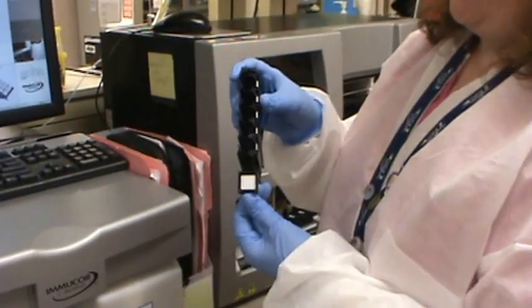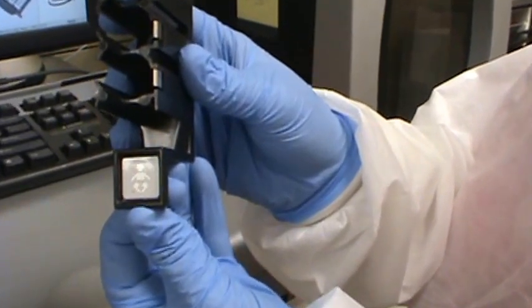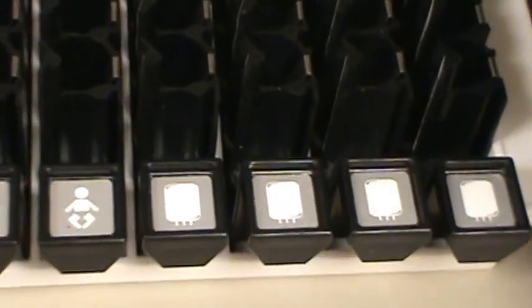The patient sample racks have a picture on them that resembles a test tube. There is also a baby rack that has a picture of a baby on it. And also we have a rack for our donor confirmations.